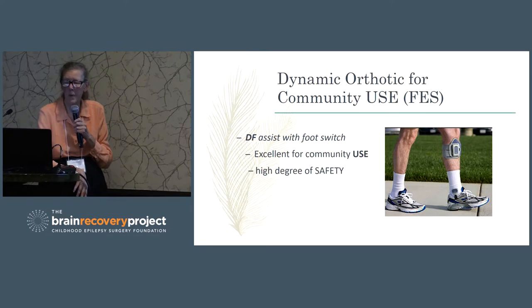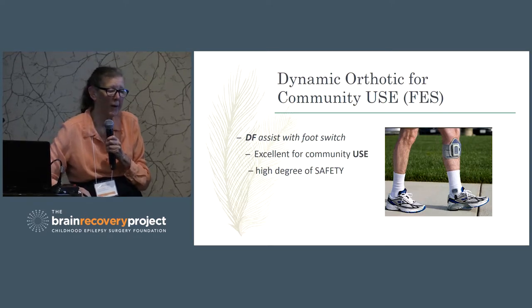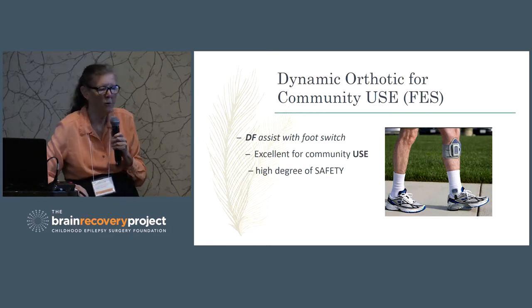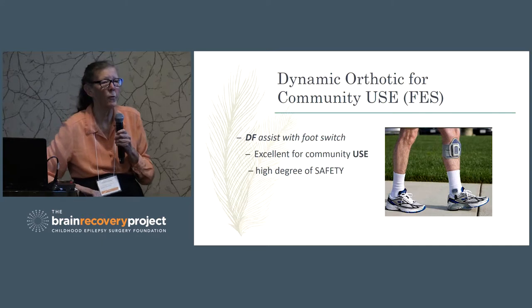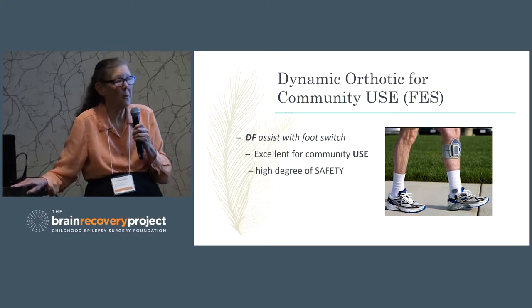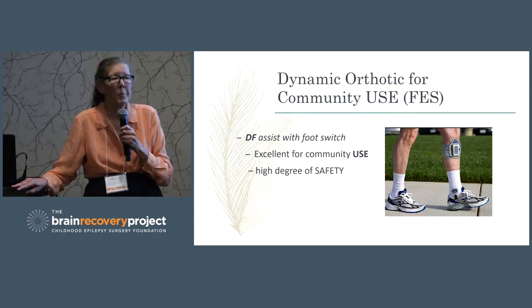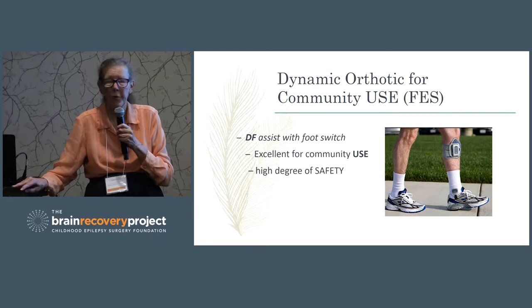Now, moving off of the therapeutic side, going into the orthotic side. After a trial with the dorsiflexion assist, if it turns out that your patient, your son, your daughter, whatever, cannot learn to dorsiflex the foot, there's just not enough strength or not enough coordination there, then we look at a true dynamic orthosis. Again, we were doing dynamic orthoses back in the 60s, and it worked very well. The big problem was we didn't have good surface stimulation systems, so everything was being done by implant, which didn't turn out very well.